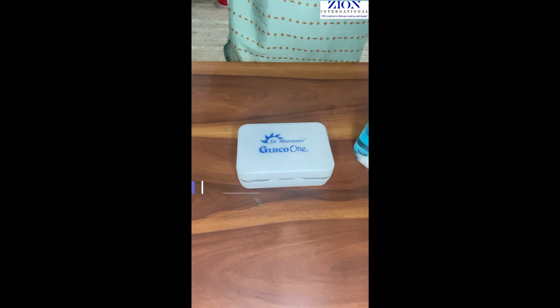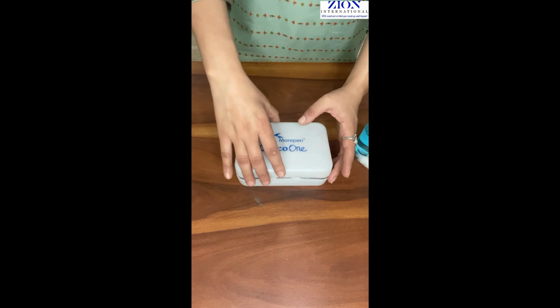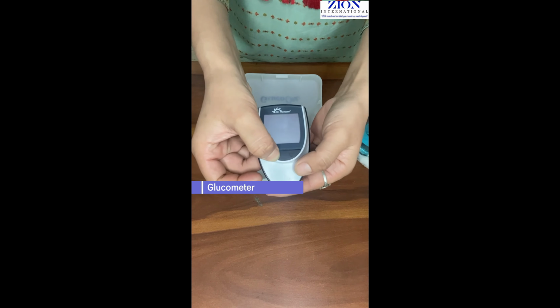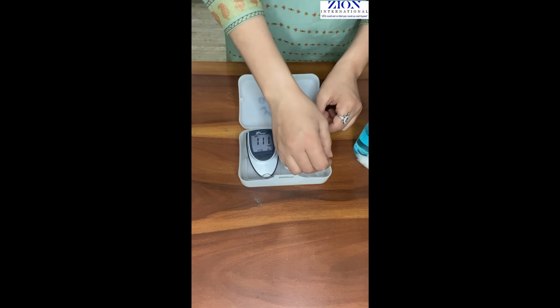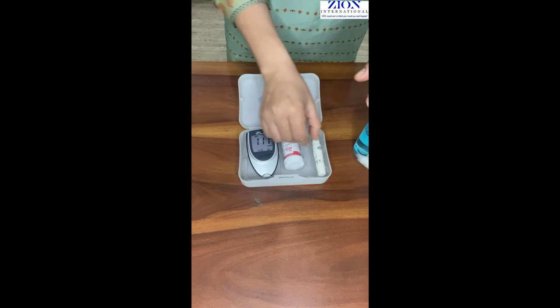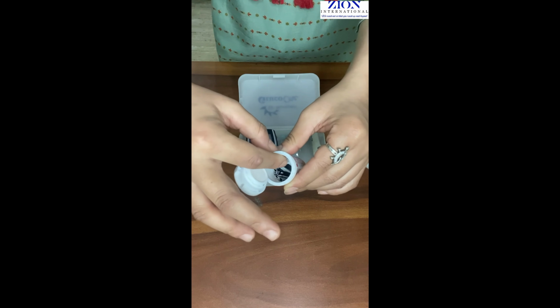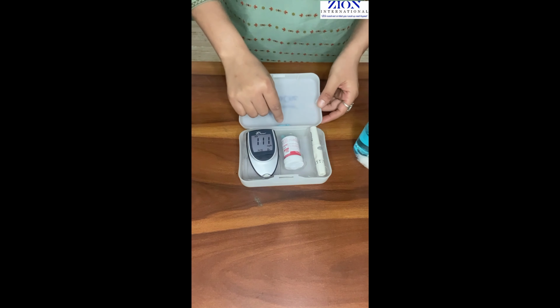How to check your sugar level easily at home. First of all, let us prepare the set of glucometer. As you can see in the box, there are a few things. This one is the glucometer. Next is the Lancet pen. This is the strip. And this one is the needle.